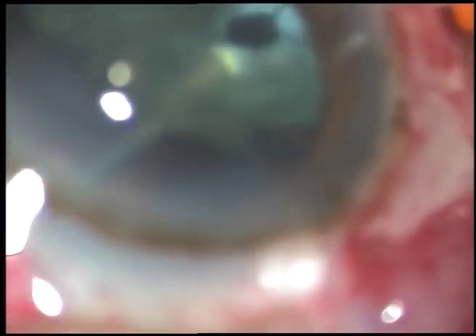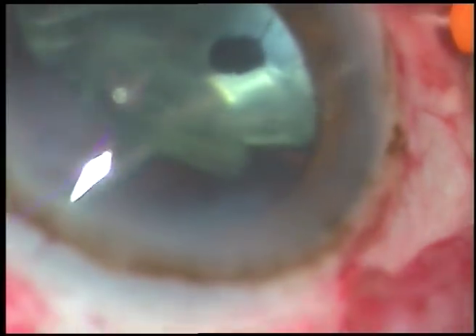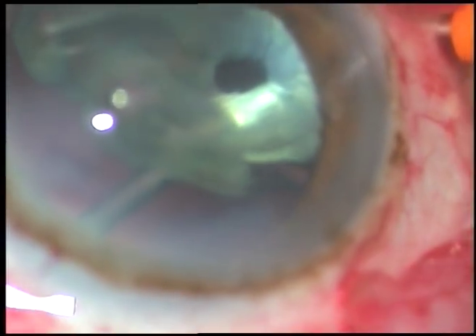I tried to emulsify this big chunk with a fragmatome, but I could do it only partially. So I have planned to lift it up, and I have supported it with the light pipe and brought it into the anterior chamber over the iris.